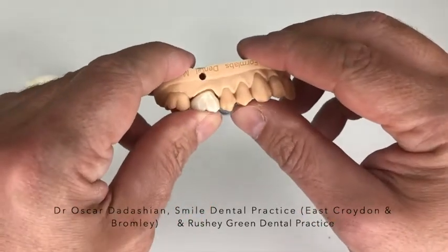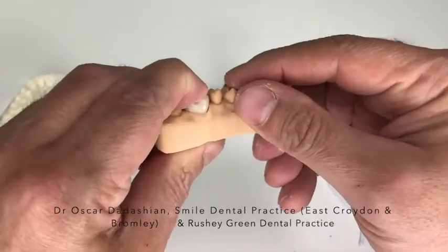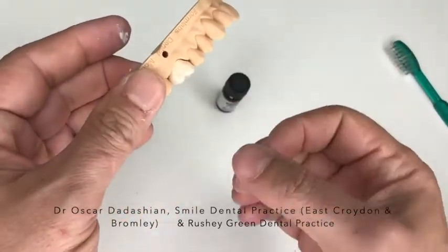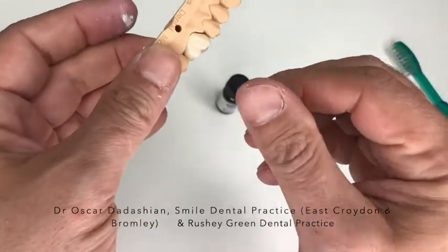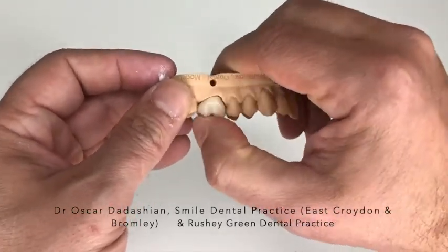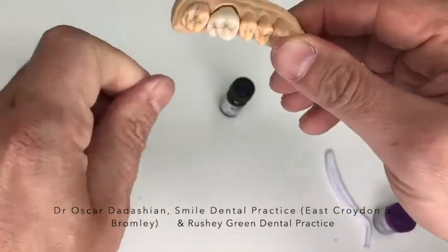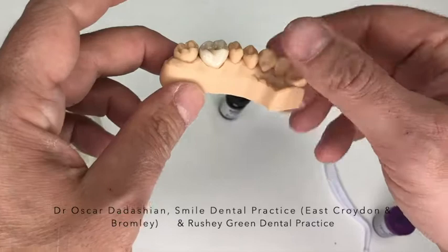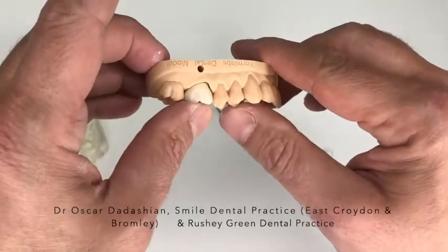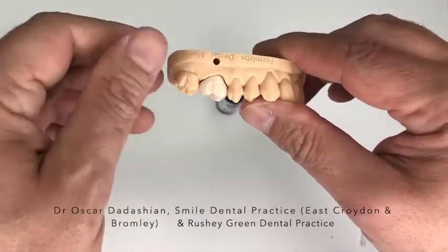So then you have to gently press it in, make sure it goes in place. And that's the time you then start biting on it and make sure that it goes in fully. Obviously don't bite too hard to break your tooth, but definitely bite on it, make sure it goes in and it feels comfortable. Now, if you put too much material in there, when you bite together, it's not going to go in. Even if you put pressure, it's not going to go in. So that's very important that you don't put too much material in.